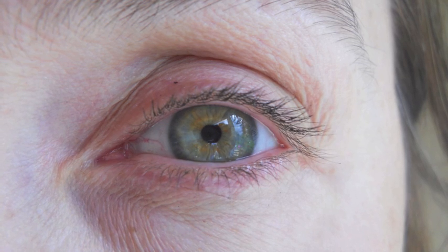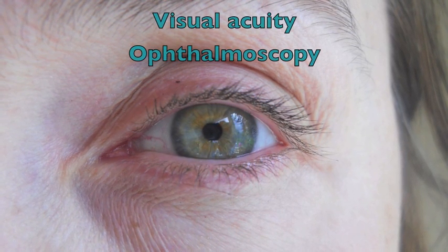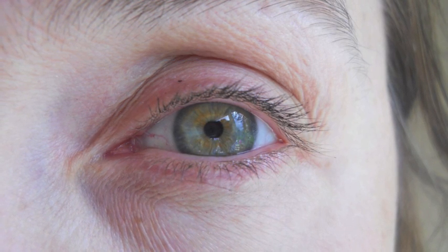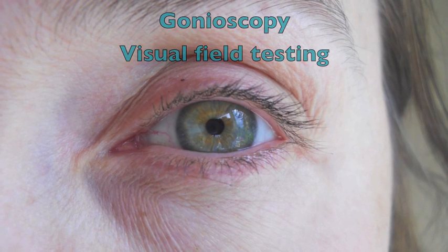If the IOP is found elevated, further evaluate the patient by determining visual acuity and performing ophthalmoscopy. The patient should be evaluated by an ophthalmologist with tests such as gonioscopy and visual field testing.